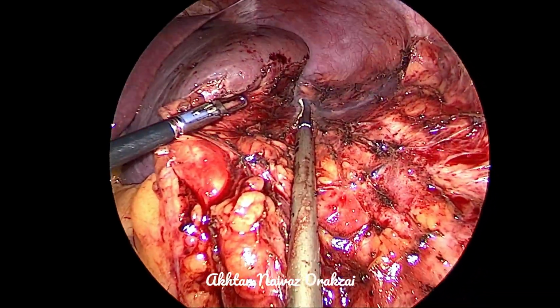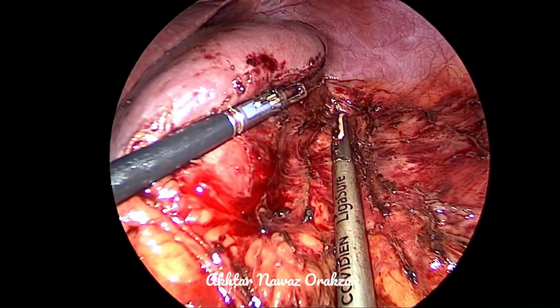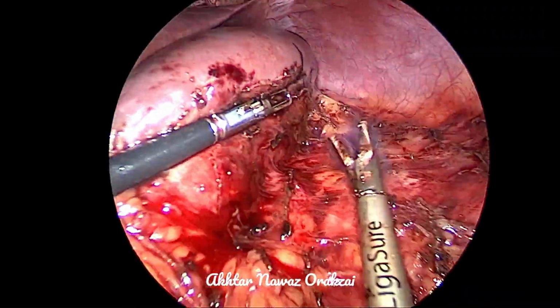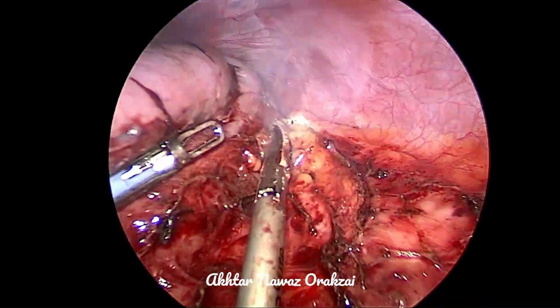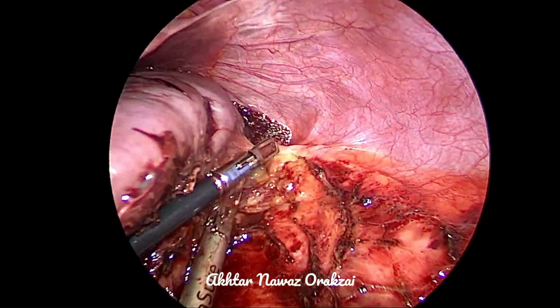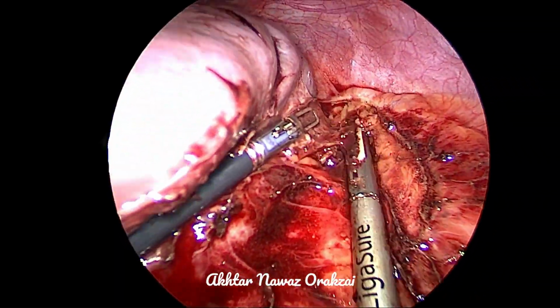So here our main purpose is to dissect the spleen as far up as possible, so that we can have a good exposure, because in such cases, if the exposure is not good, one can injure the structures surrounding the kidney.